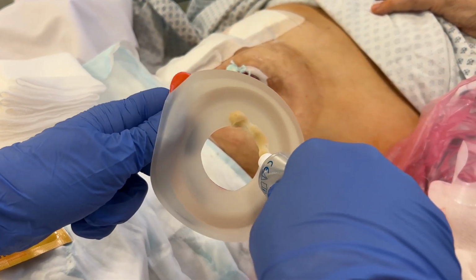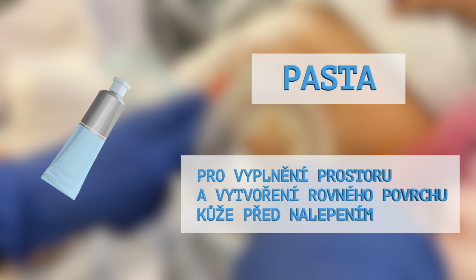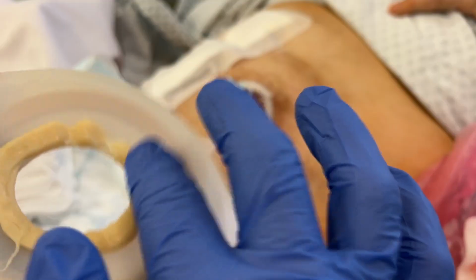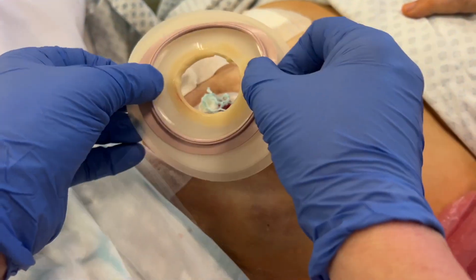After removing the protective film from the base plate, we apply adhesive paste around the cut opening and let it set for approximately 10 seconds. The paste fills minor irregularities around the stoma, preventing leakage of contents under the appliance, thereby helping to maintain healthy peristomal skin. The adhesive surface should not be touched.